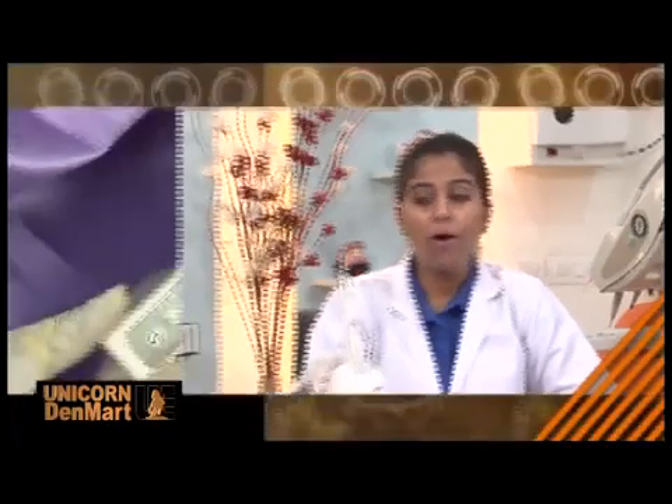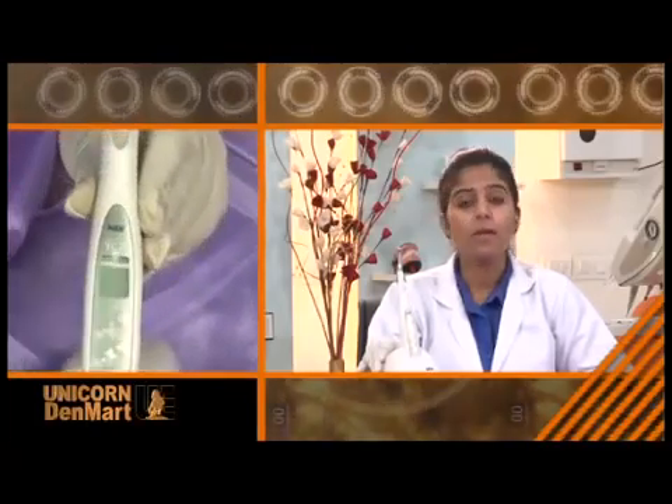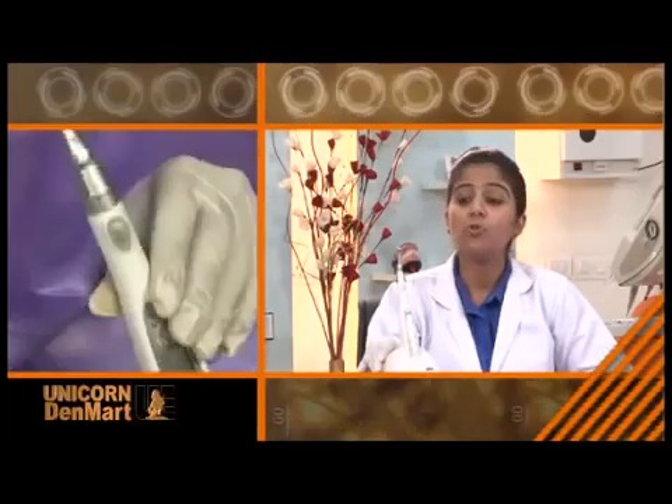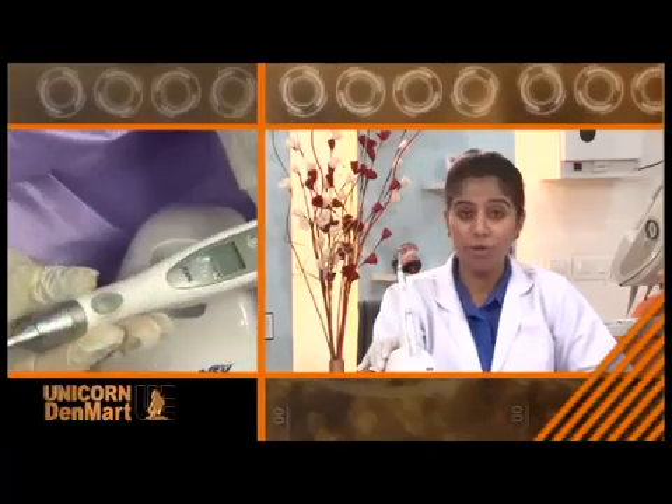These days, smart and safe technology is a must in any dental clinic. Understanding this ever-evolving need, Unicorn presents the Endomate TC2 — a combination of ergonomics, aesthetics, and convenience for the user to enjoy the freedom of movement during various delicate and critical dental treatments.